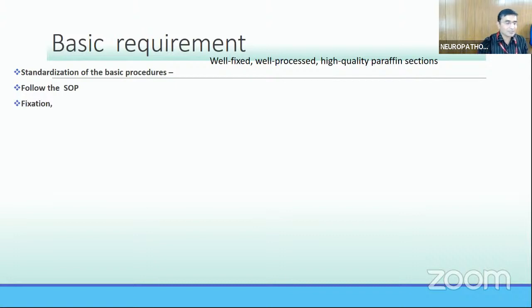Now, people may ask which fixative, but overall, neutral buffered formalin of 10% strength is best. But sometimes we use the best fixative and proper time, and the problem is there will be delay in fixation. That means after surgery, they may not have placed the tissue in the formalin. That causes autolysis or degradation of the proteins, what is referred to as ischemia or cold ischemia. That especially affects prognostic markers like ER and PR. One has to be very careful. That's the reason I was telling you the factors start right from the time a biopsy procedure is started.